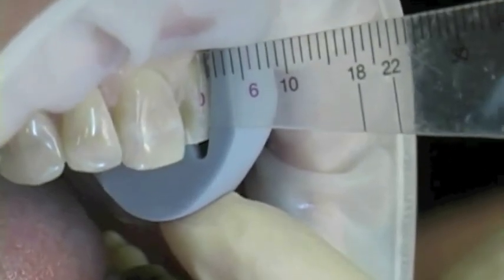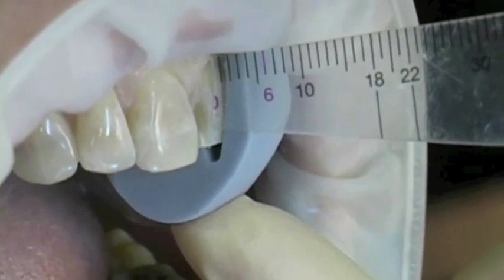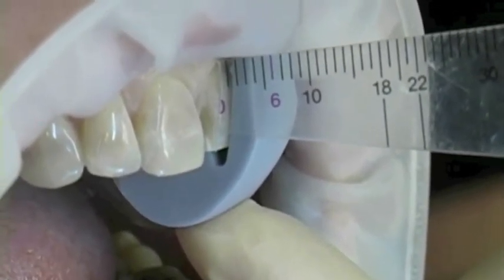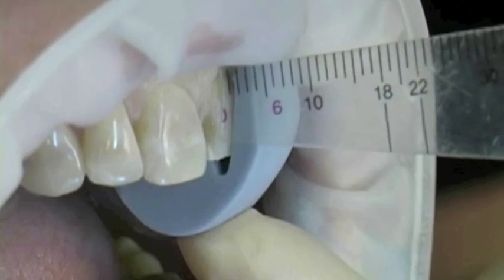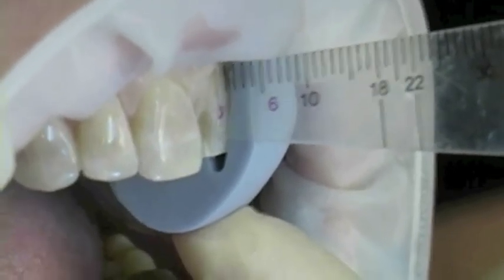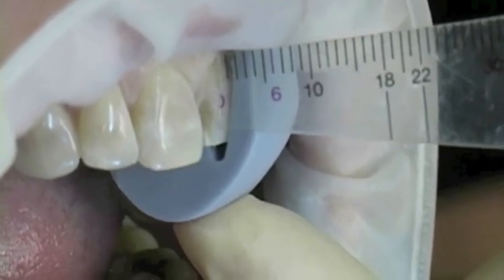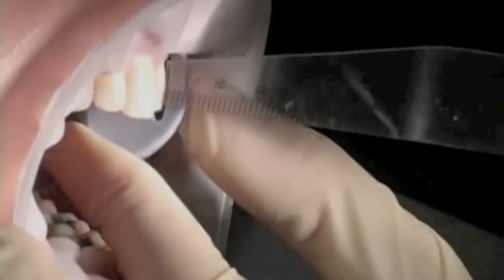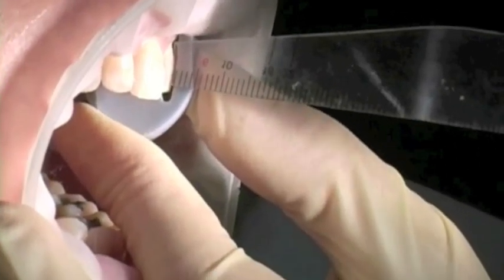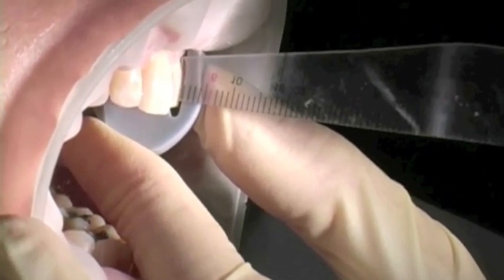This is the basic denture ruler, which I've cut off. It usually has an extension beyond the actual zero, and I've cut it at more or less the facial plane of the tooth so it sits just like that. You can actually do your measuring to see exactly where you are. Obviously I need more facial reduction in the incisal two-thirds, so we're going to make that reduction now. And the index from the side — this is the view that you actually want to look at. We're trying to measure exactly how far of prep reduction we have.